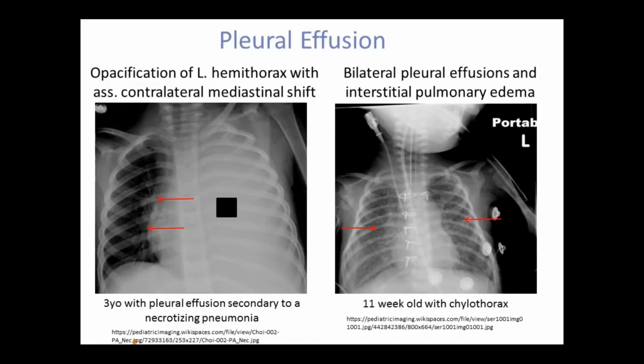If a pleural effusion is suspected, an ultrasound of the chest should be carried out to determine whether the fluid is confined to one area or free moving, the latter of which lends itself to percutaneous drainage. An ultrasound will also help determine the quantity and quality of the effusion.